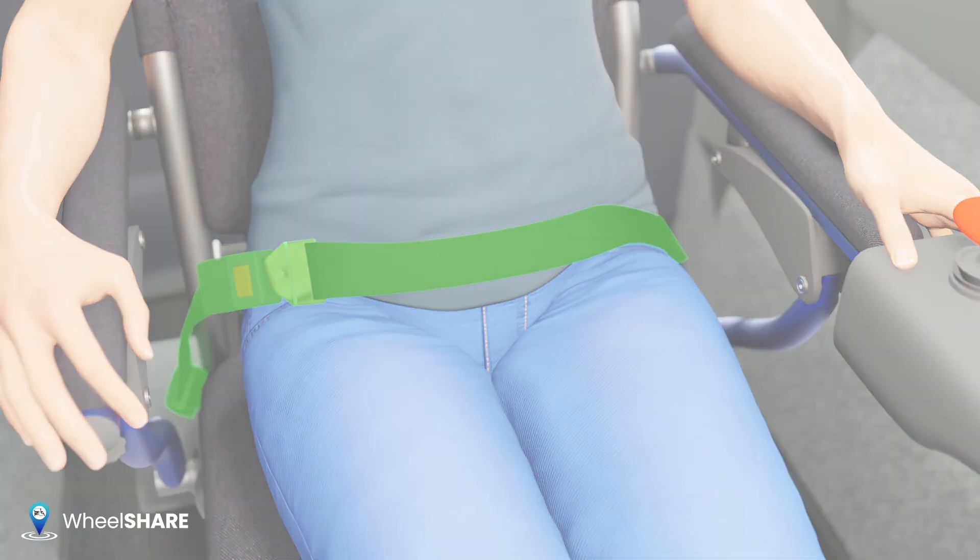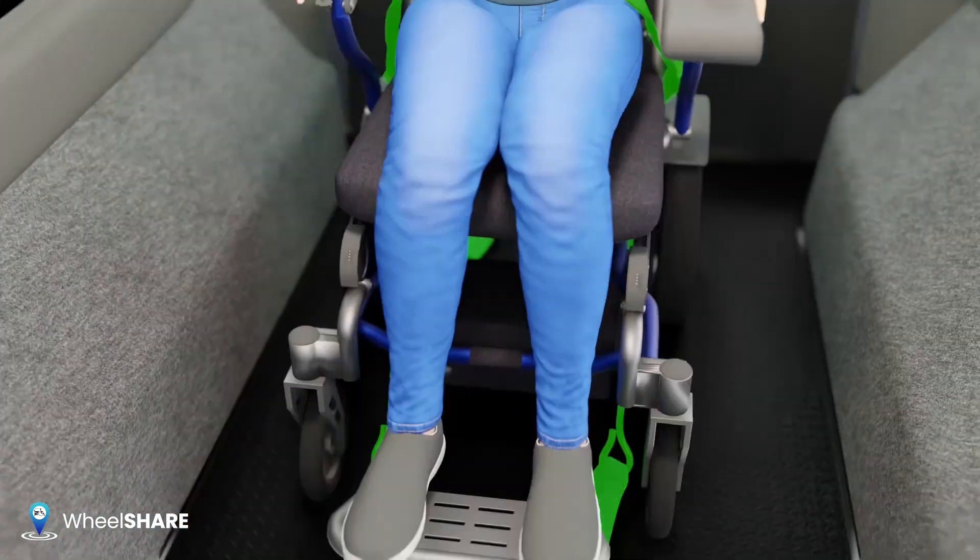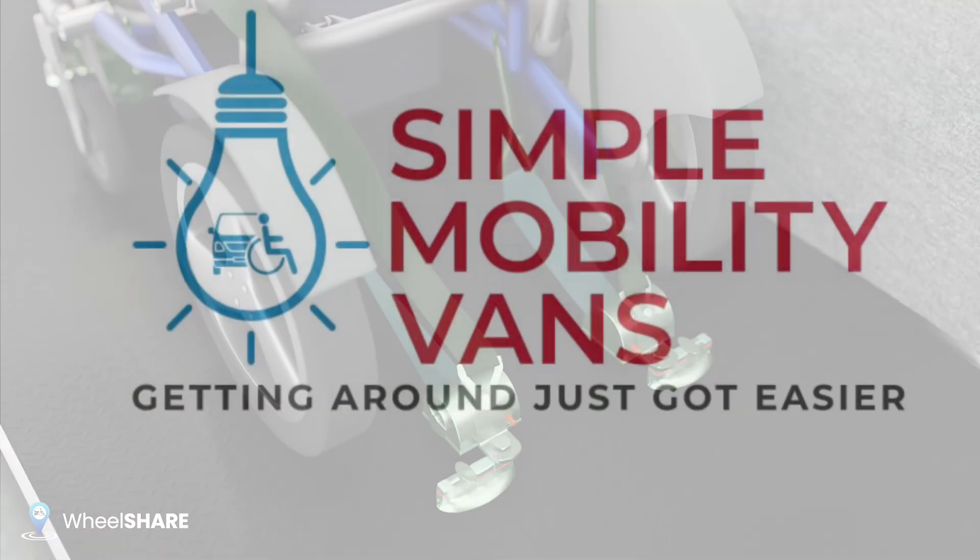Tighten until snug. Attach the shoulder seat belt against the passenger's body and tighten until snug. Your passenger is now secure.